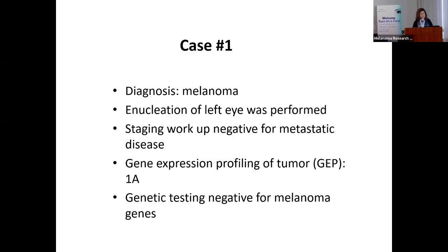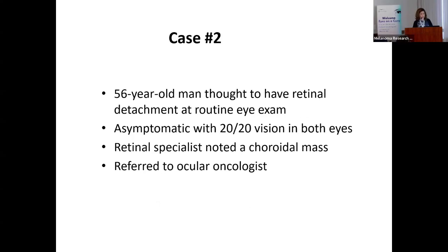This patient was diagnosed with melanoma. Because of the large size, enucleation was performed, and he had gene expression profiling. He had a 1A, and his genetic testing was negative for melanoma genes. So that's a spindled melanoma.